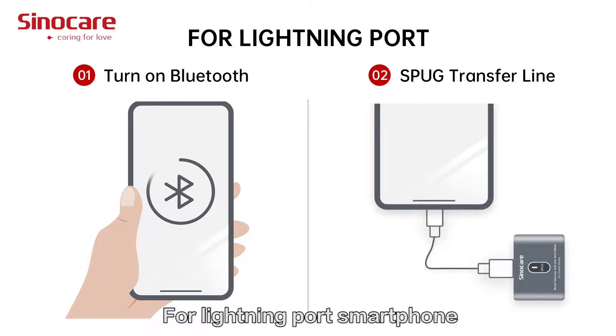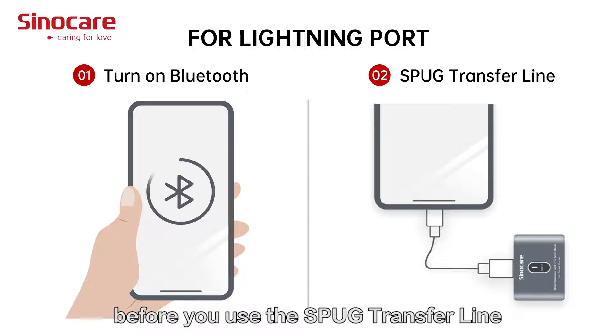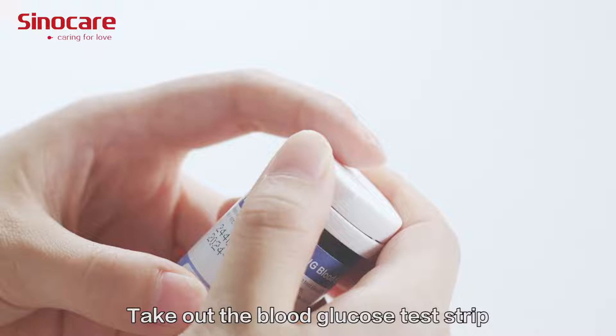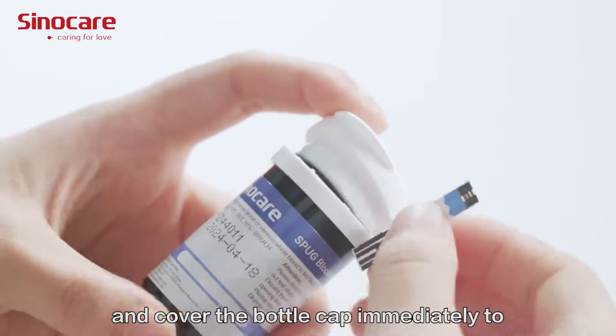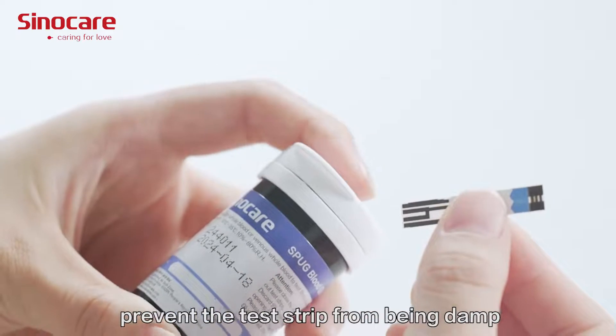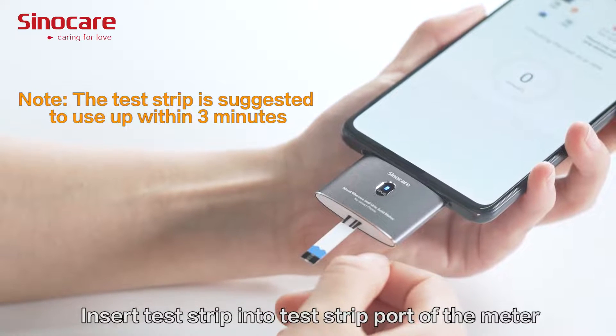For a Lightning port smartphone, please turn on Bluetooth on your phone before using the SPUG Transfly adapter. Take out the blood glucose test strip and cover the bottle cap immediately to prevent the test strips from becoming damp.